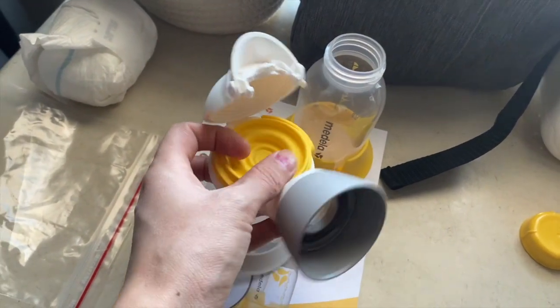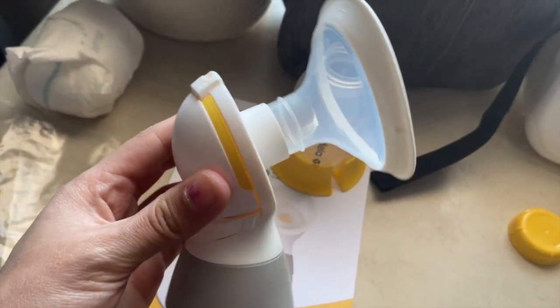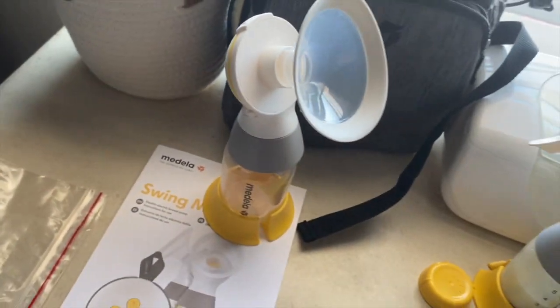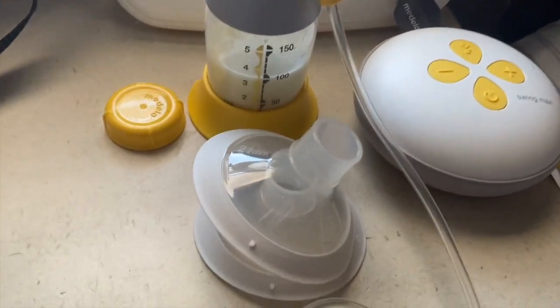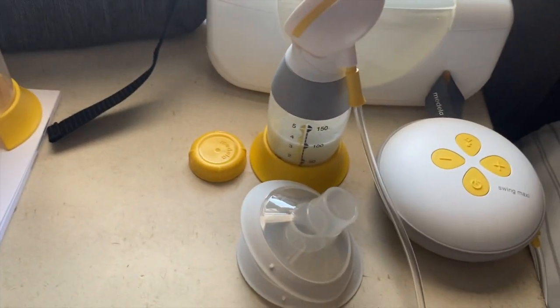Do you guys remember the older pumps where you had to swap out all the little pieces? They made it so much easier with this design. This is off of just one side after pumping — I'm going to finish pumping when the video is done.